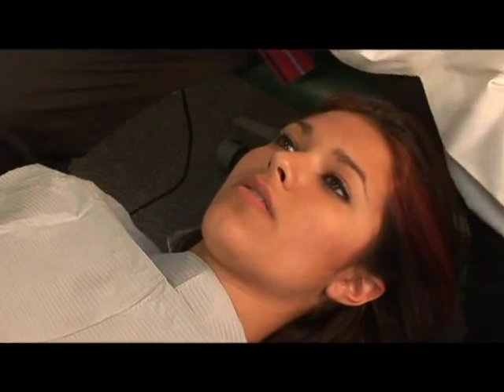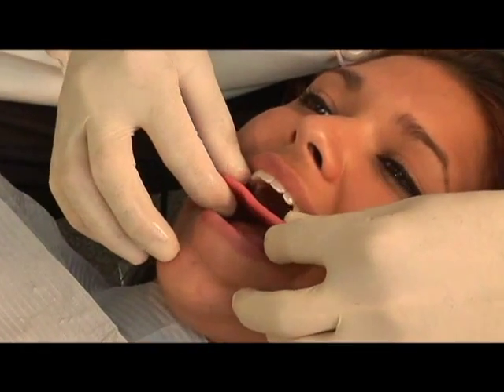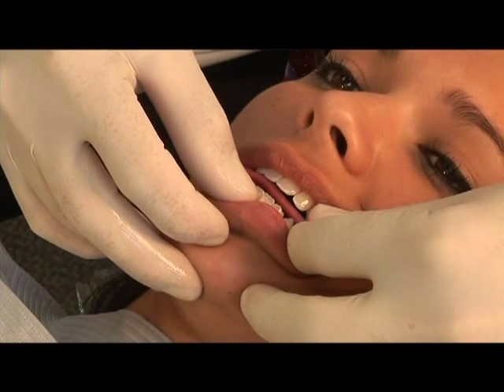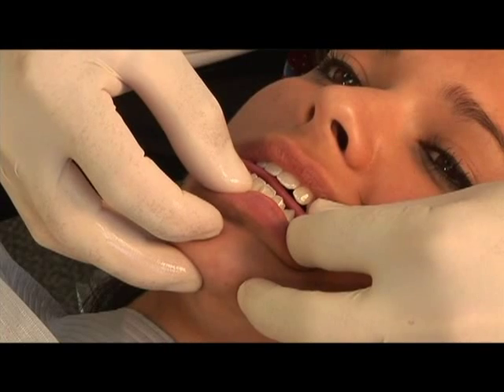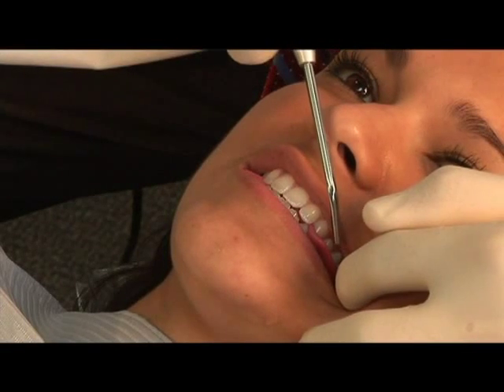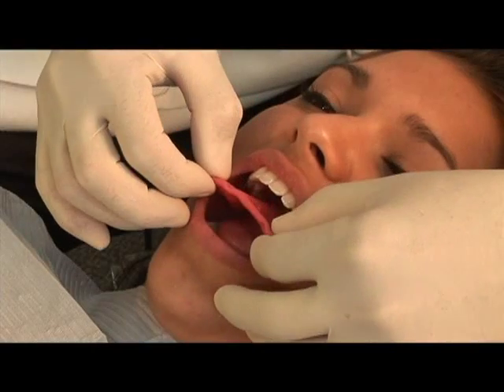Once the wax has been softened, place the wax record into the mouth. Instruct the patient to close their mouth, then move their teeth forward to record the protrusive record. Be sure to allow the wax record to completely cool before removing.